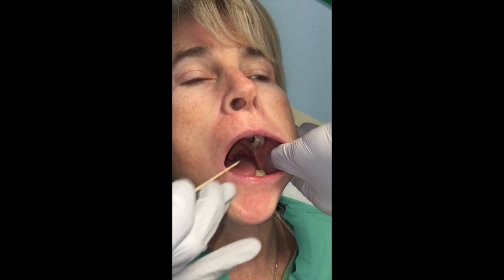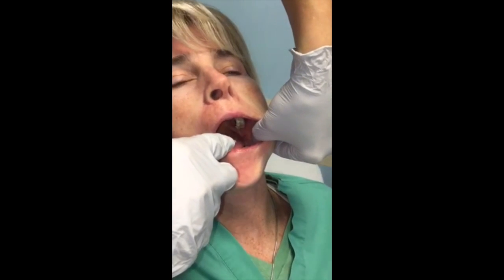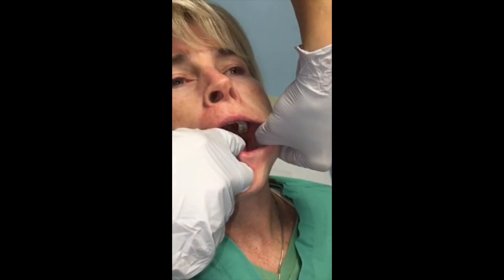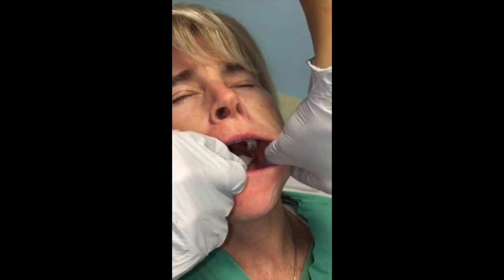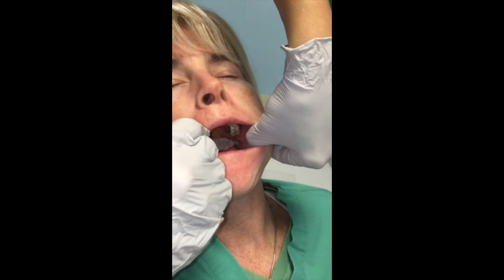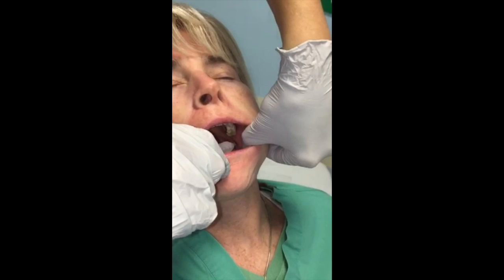But you want to come from across the mouth. Palpate. Take a big deep breath in. What I'm really trying to feel for is the ramus. You should be able to have a bony end point, and then you pull back.